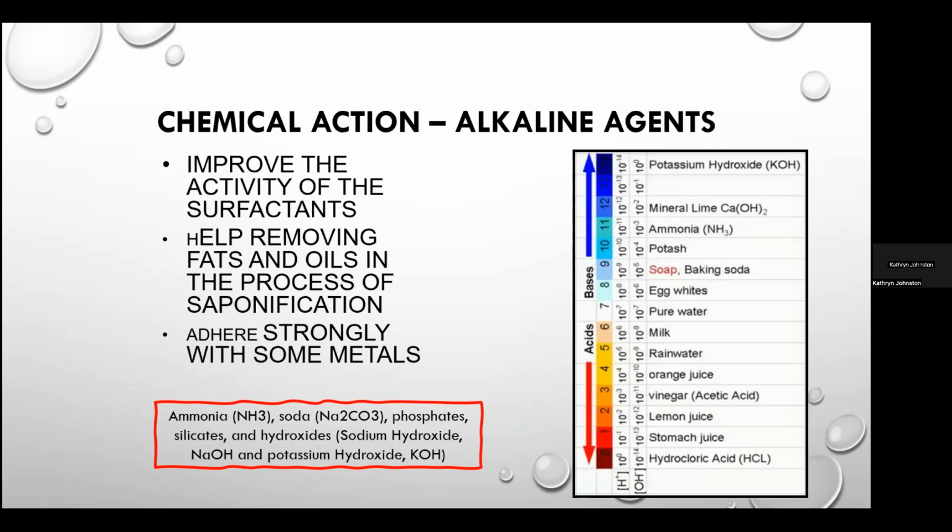A mild alkaline detergent is preferred for manual cleaning, and mild alkaline detergents have a pH range of 8 to 10.8. They're more efficient cleaning agents for surgical instruments, so metal instruments, than neutral pHs, but as I stated before, work with infection control, work with your chemical suppliers to pick what is going to be best for you within the health facility.